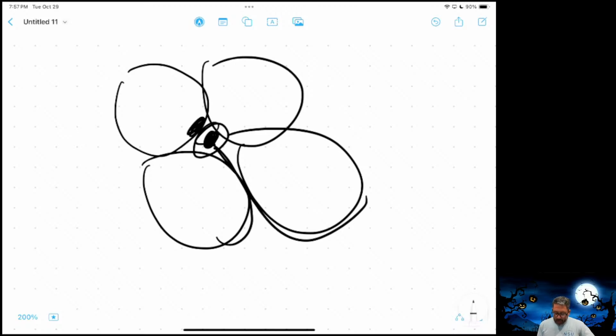If it's high enough, then it can follow almost the same pattern of a normal depolarization, and you can get a narrow QRS. If it starts down here, then you start getting the widened stuff. The wider the QRS, the further down we're kind of going. So third degrees are usually going to have a wide QRS because the impulse is generating from the ventricles. It's not following normal pathways from the SA node down.